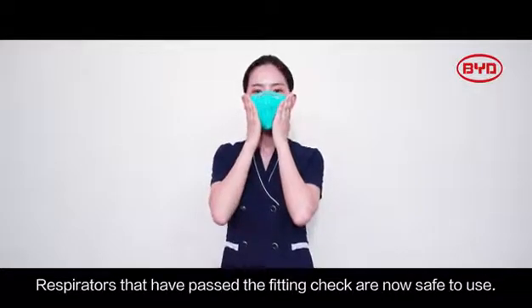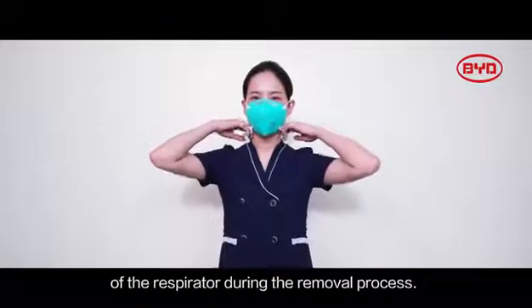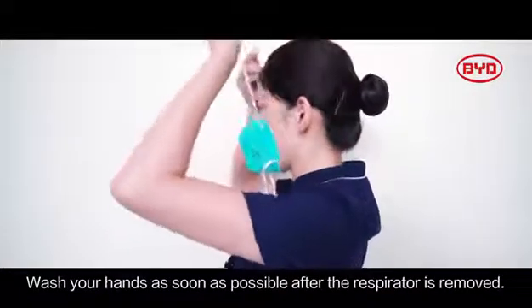Respirators that have passed the fitting check are now safe to use. Do not touch the surface of the respirator during the removal process. Wash your hands as soon as possible after the respirator is removed.